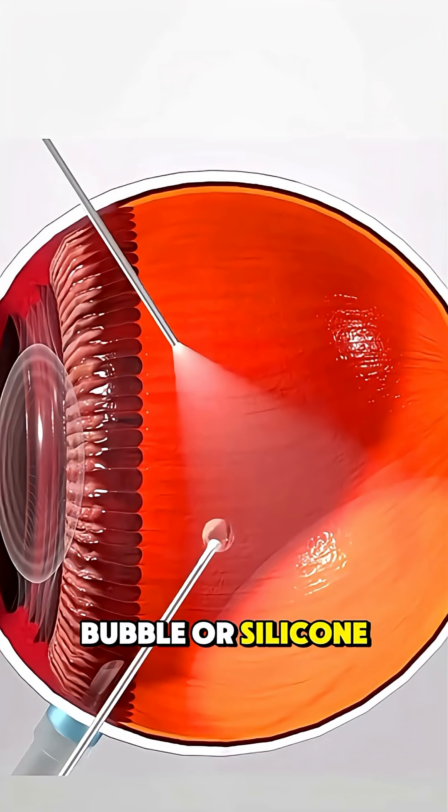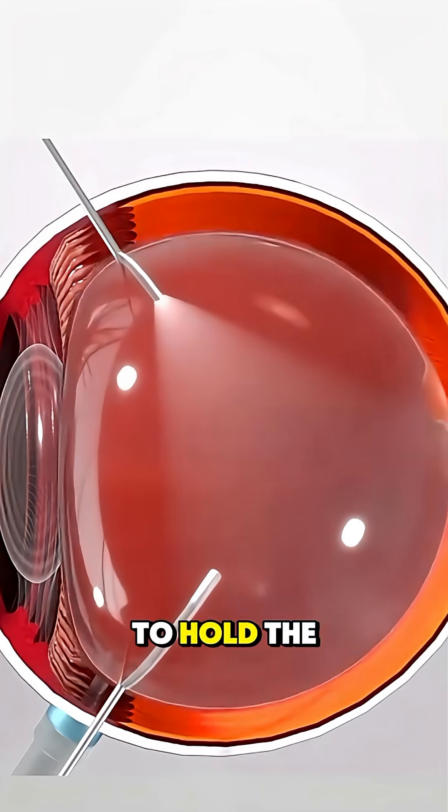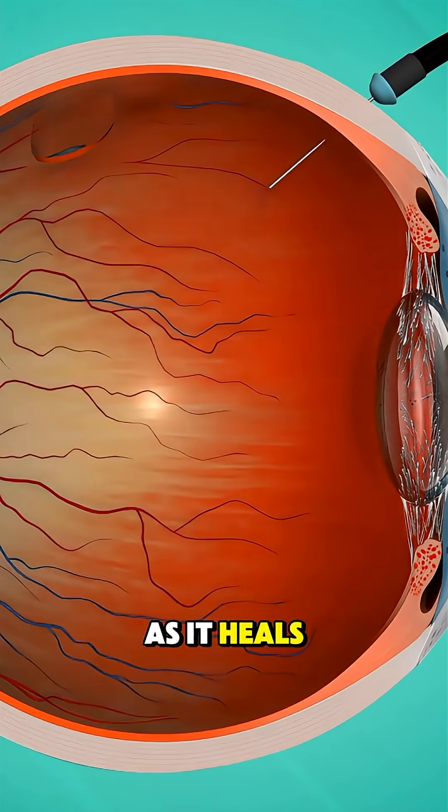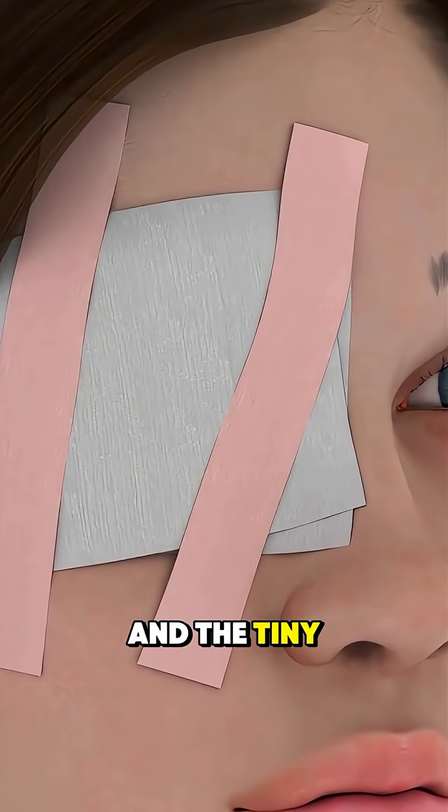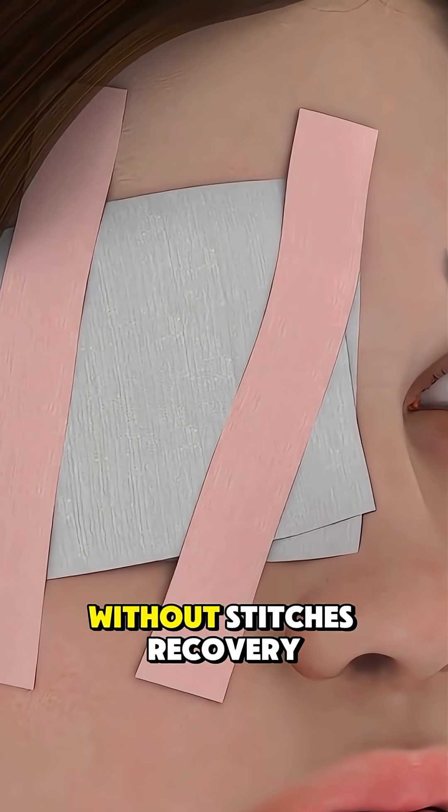Sometimes a special gas bubble or silicone oil is placed inside to hold the retina in position as it heals. Once the work is complete, the instruments are removed and the tiny incisions often seal on their own without stitches.